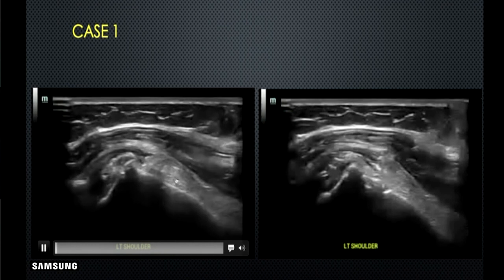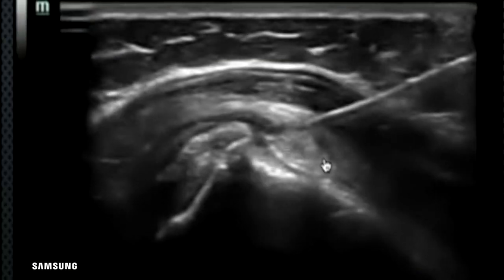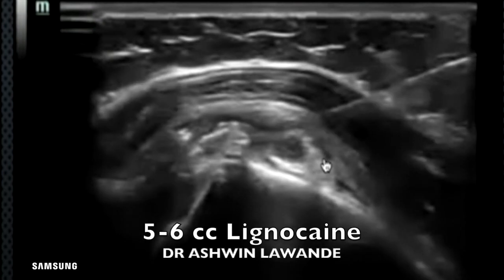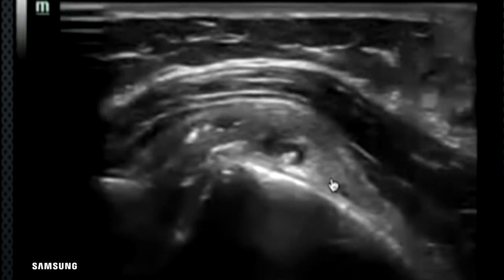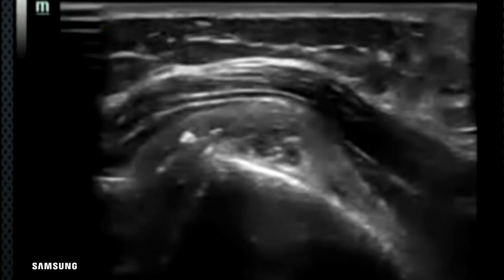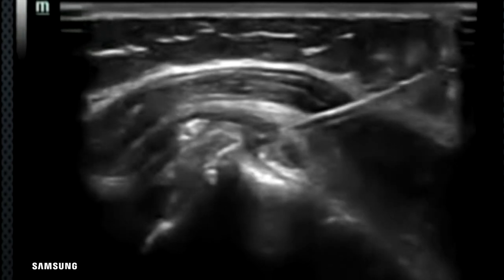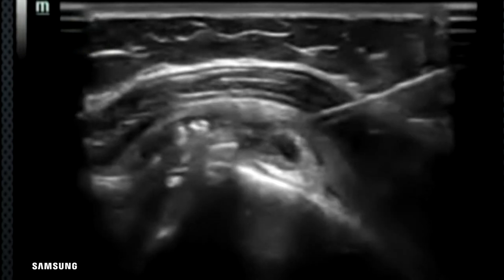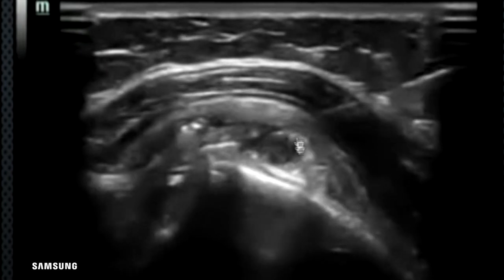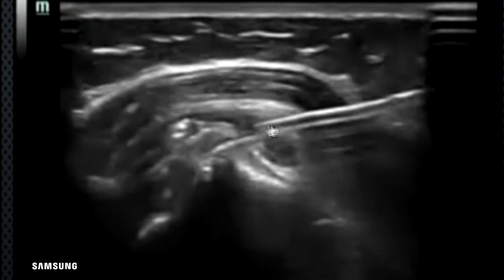After giving local anesthesia with a 26-gauge needle, insert the main 18-gauge spinal needle into the calcification. Then pulse it with lignocaine — around 5 to 6 ml. When you pulse into the cavity of calcification, whatever is injected goes into the bursa or tendon and immediately comes back into the syringe. What you get back is nothing but powdered calcification.